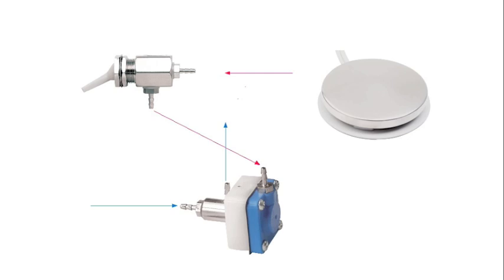Because of water impurities, these valves can often get gunked up. Some have a diaphragm, which can also become damaged. While these can be disassembled and cleaned, it is often easier to just replace the valve.